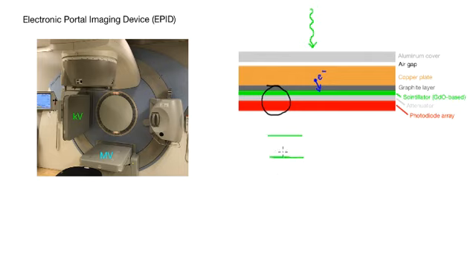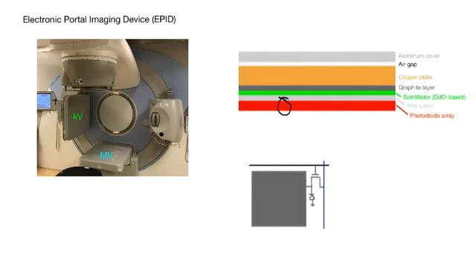So you have a scintillator layer, the green, and this is typically a rare earth, like for example, gadolinium oxysulfide. And what happens is that when you have a charged particle interacting here, it emits light. It emits photons, optical photons. And they come out through the layer, and then they are registered or detected in the system below it, the photodiode array, typically made of amorphous silicon, and that provides some readout of the charge from the number of photons that are coming out. So let's look in more at this photodiode array layer.